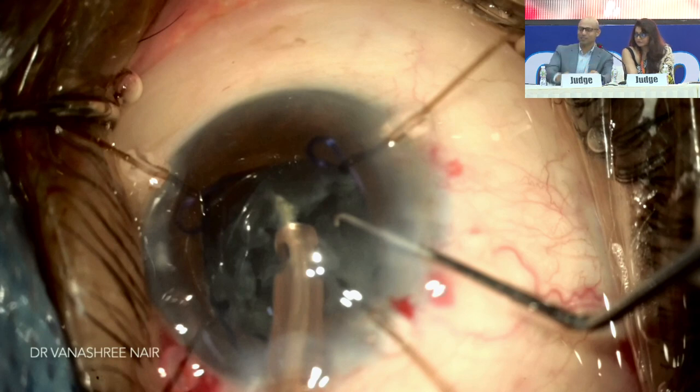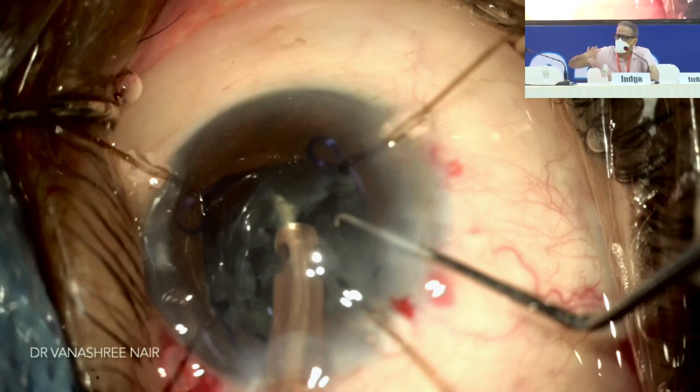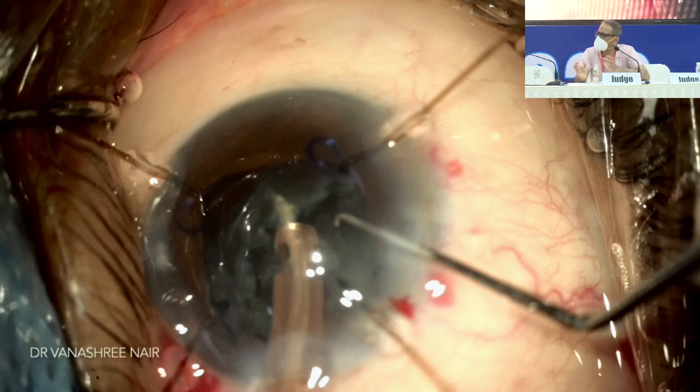Sometimes the Sinsky hook can slip. Yes. So direction of insertion is also very important, how you have to insert the CTR. If the zonular dehiscence is less than 90 degrees, then it can be anyway. But if it is more, you have to go through the area which has the maximum zonular support and then move on. So it can be clockwise, anti-clockwise, depending upon the location. Very good tip, because if you start from the dehiscent area, you will never go ahead. You can do it only if it is less than 90 degrees. Right. But if it is more, as she said, you know.